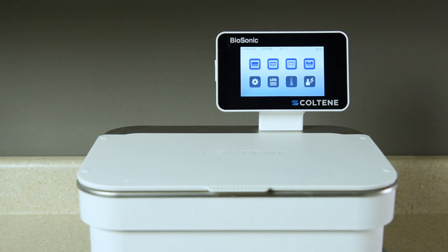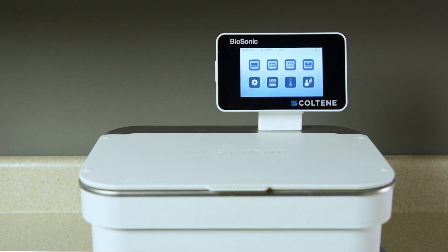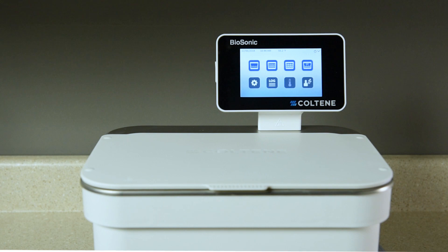Congratulations on your purchase of a Biosonic ultrasonic cleaner. To set up your UC150 for the first time, just follow the steps in this quick start guide.